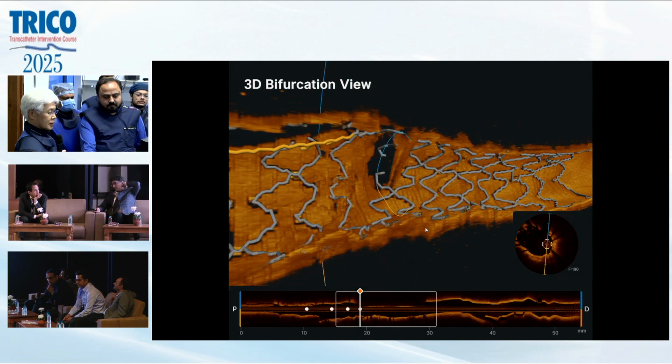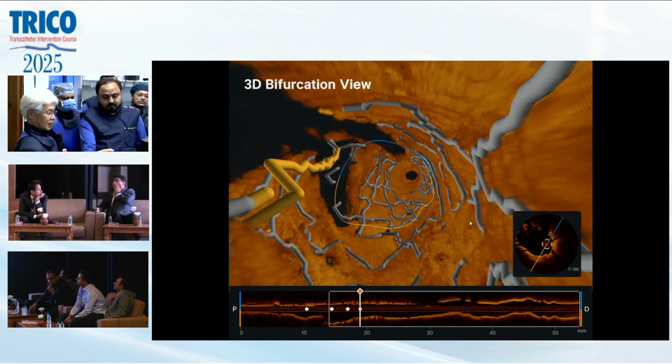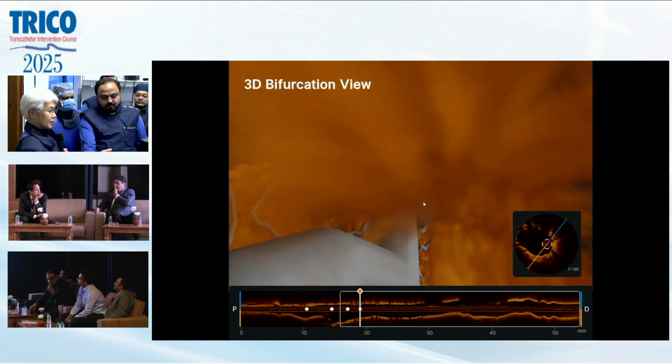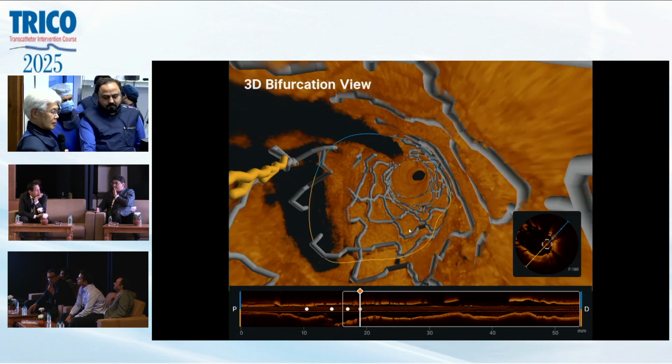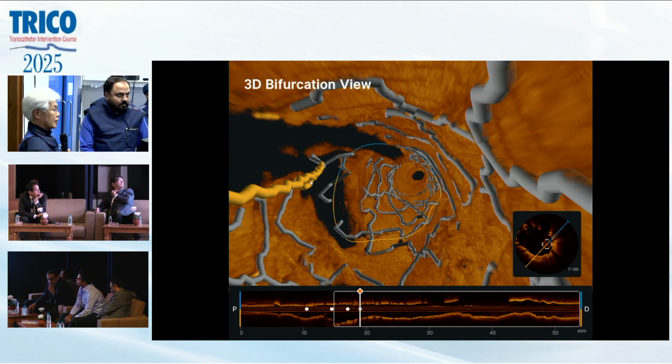And I'm just afraid too much bifurcation lesion treatment makes deformity of the main vessel, right? So if you try to do the kissing, the wire should go through the distal strut, here or here. Correct. Otherwise, I cannot recommend the kissing using this wire, because this strut goes up to the main branch.